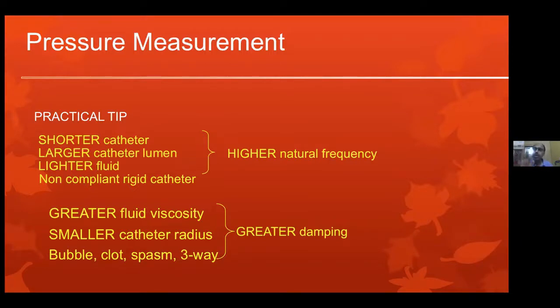So I should have an initial flick that is slightly taller than the plateau of the left ventricular systole, and I should have a tip of the diastole that should be at zero, and it should maintain a diastasis, a plateau. Now let us assume my left ventricular flick is 30 millimeters of mercury higher, and then it forms a plateau. And then in dip of diastole, it goes to minus 20, and then it comes back to a plateau at around 5 millimeters of mercury.